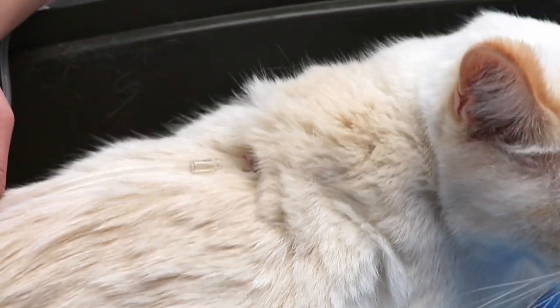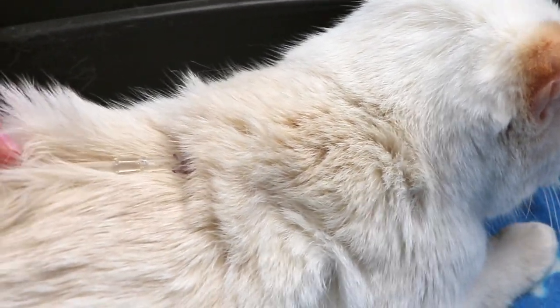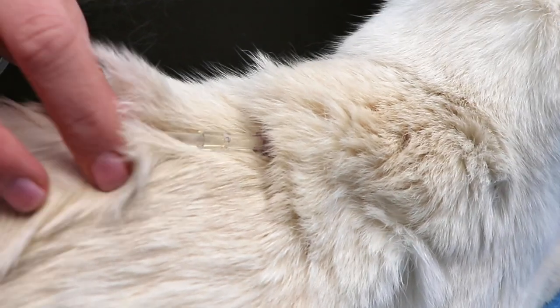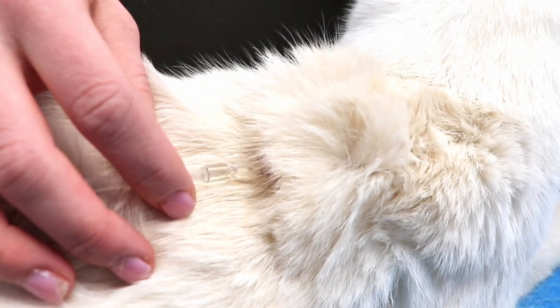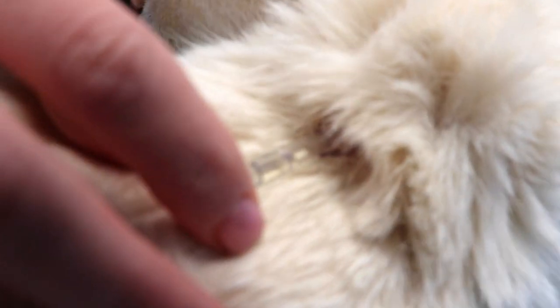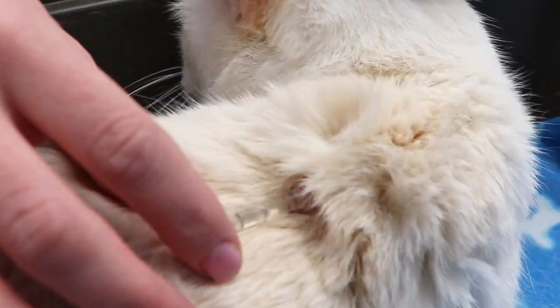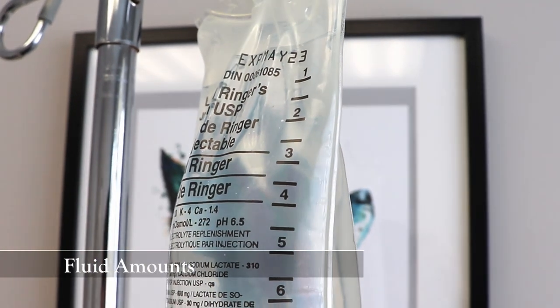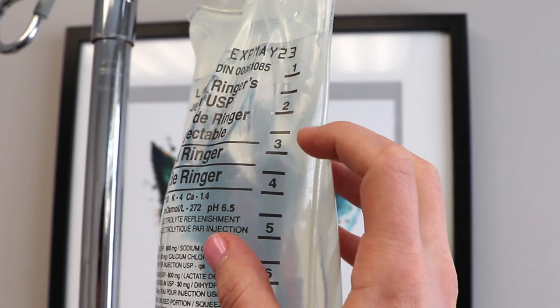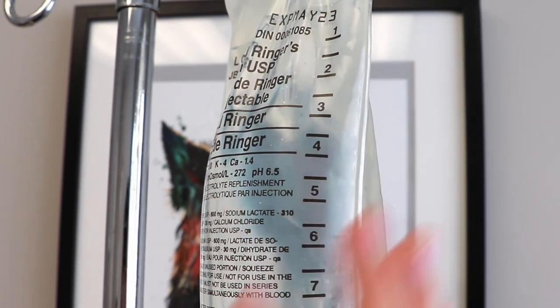And then if the fluids ever kind of stop flowing at a certain point, it can just be that the opening of the needle is occluded somehow, so you can try to reposition it a little bit, and then it should keep going. This one I'll do for today, and when you do it, I would say go down to the one right there, and then there the next time, and then there.